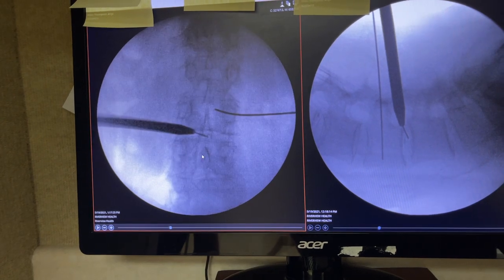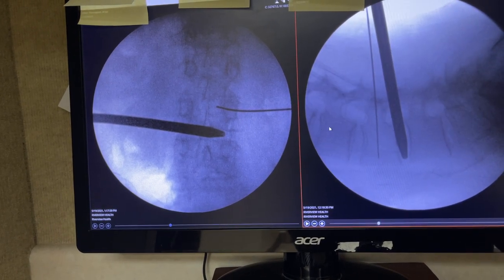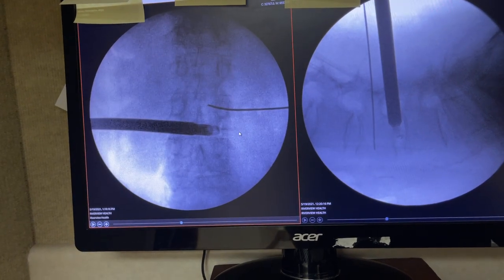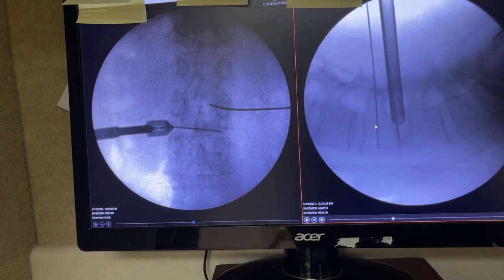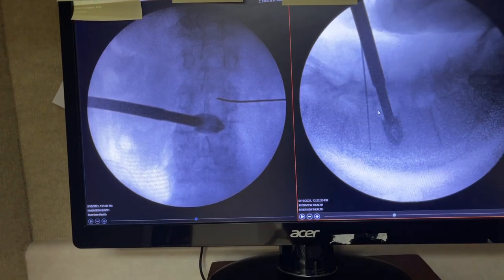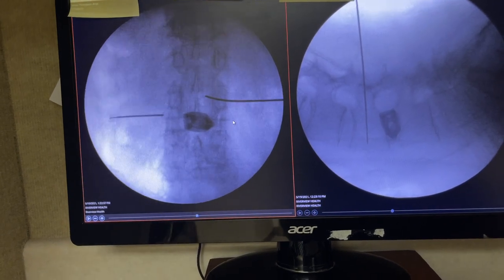Then we dilate, but before we dilate we adjust the angle so it is aligned. Here is the distraction of the pedicle, then we drill — use a drill to open a space — then put a series of disc preparation devices. Once we have packed the space with the bone marrow, we retract the K wire, the cage is inserted, and you see that this action really opens up the disc here.